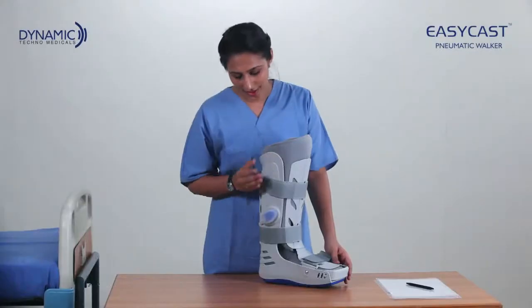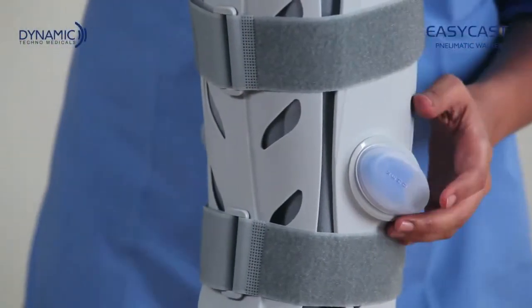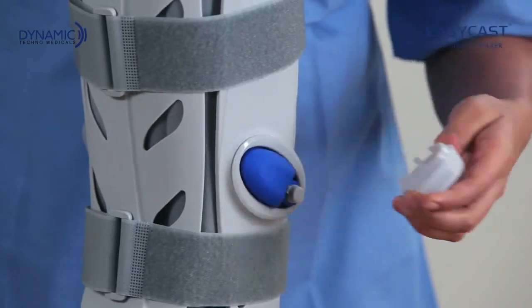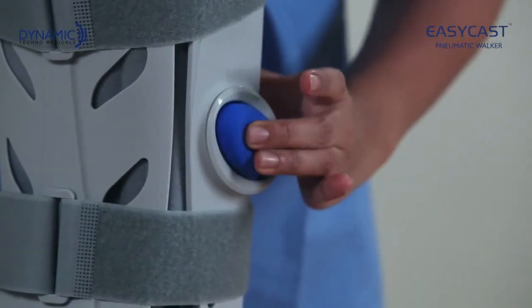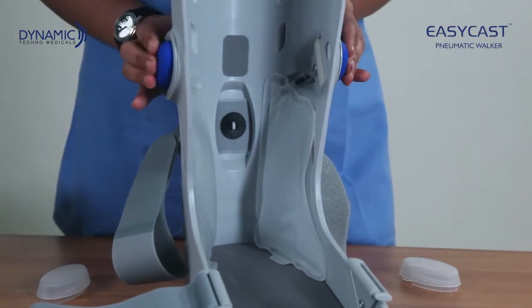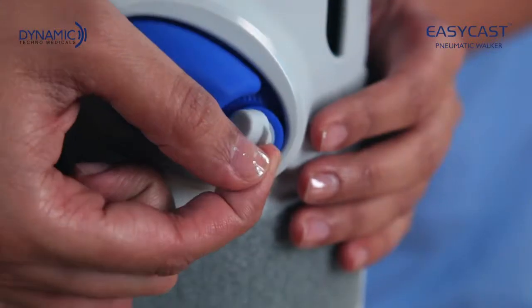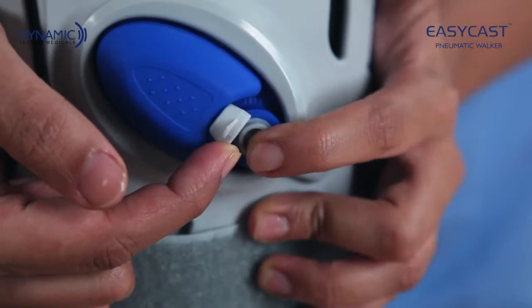The inbuilt inflation pumps can be inflated by gentle press action after removing the lid. This inflates the air cells of the EasyCast Pneumatic Walker and offers pneumatic compression for a total contact fit. Pressing the small deflating valve controls the air pressure level.